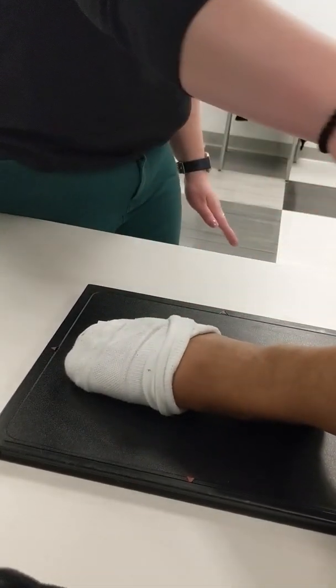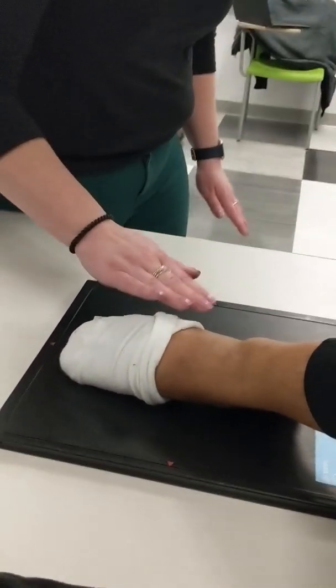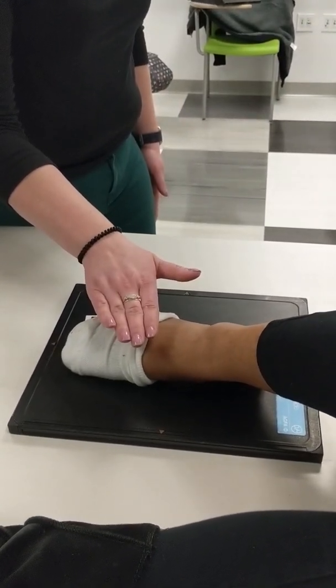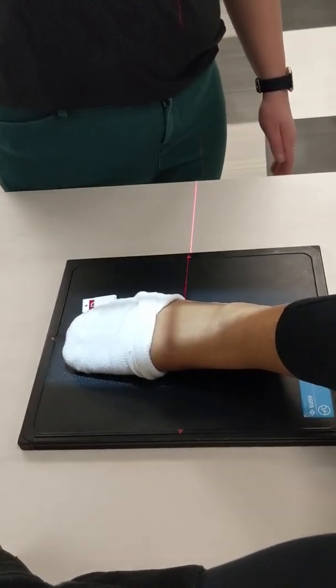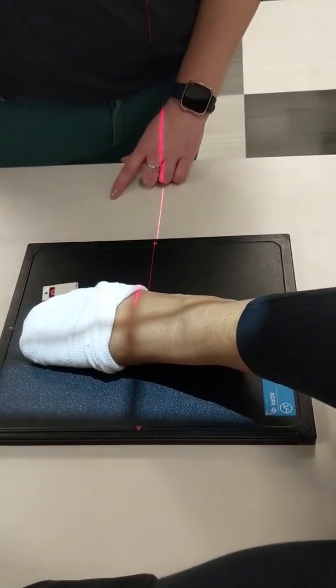So we've rotated her in. Are you okay? Okay. So we've rotated her in until this dorsal portion of her foot is parallel with the IR. We're going to check that we still are centered at the base of the third metatarsal, which we're not. We're at the level of it, but we need to change so that we're centered over the base.